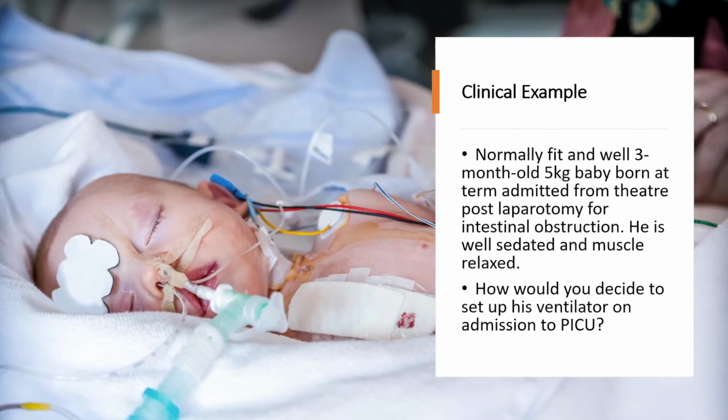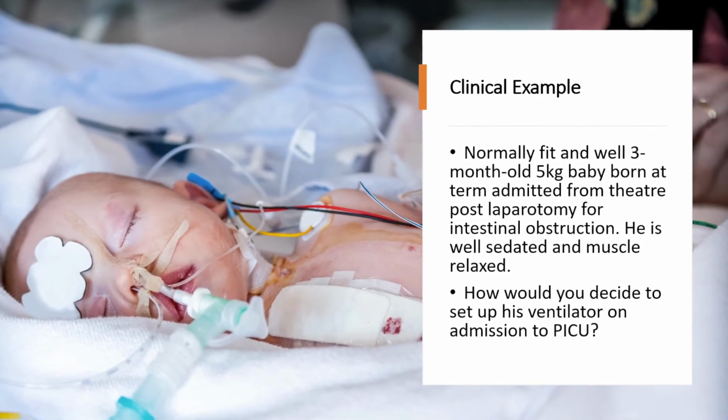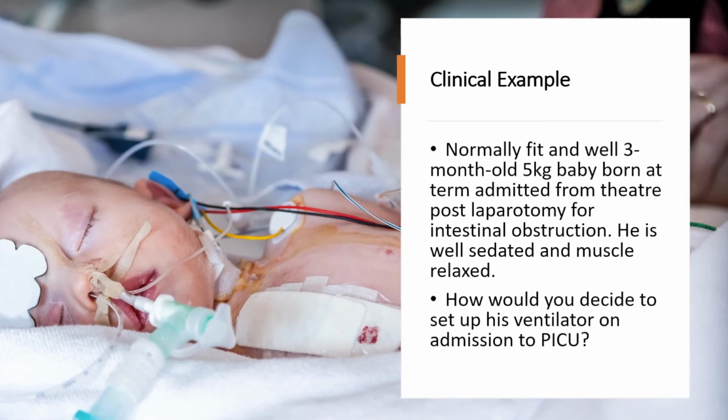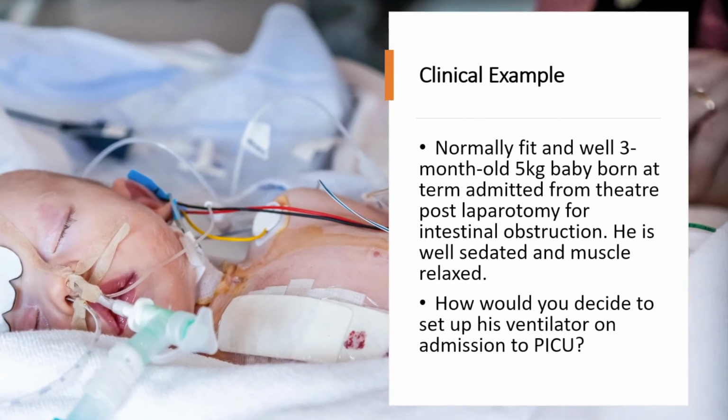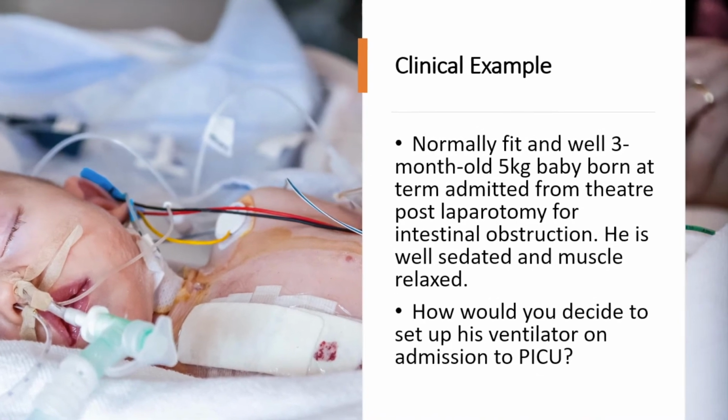Now let's look at a little clinical example. So let's look at a normally fit and well 3-month-old 5-kilo baby who was born at term. So he's been admitted from theatre post-laparotomy for intestinal obstruction. He's well sedated, muscle relaxed.